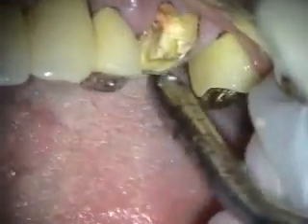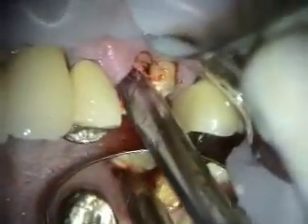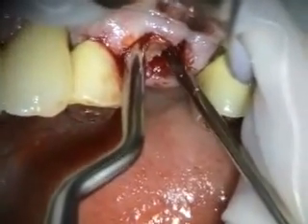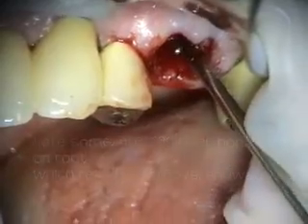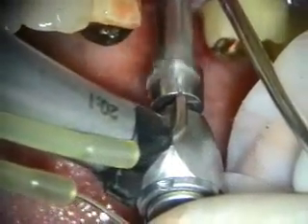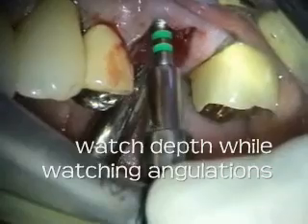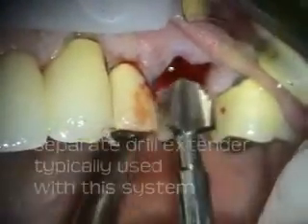Here we decoronated the crown, and that gives us a little better visual access to sectioning it. A lot of vibration and water again.